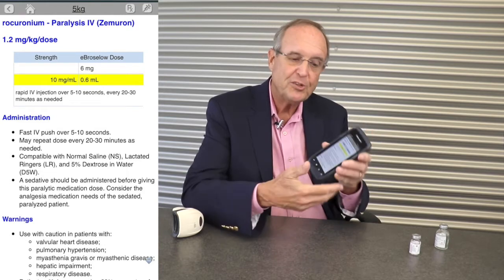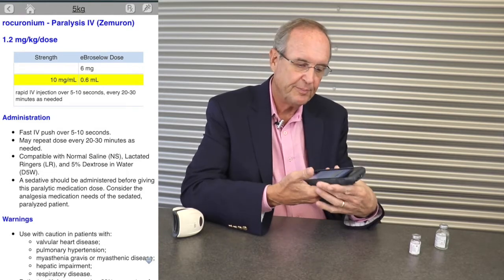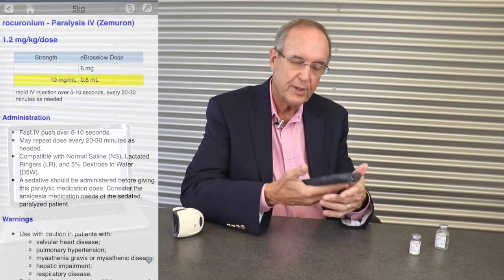Once the patient is paralyzed, I want to document. I select event note and I can even dictate in the note — number three endotracheal tube.